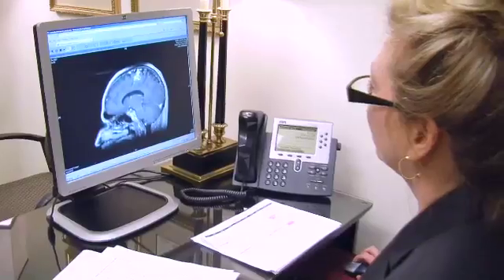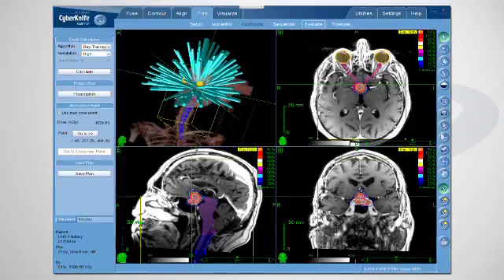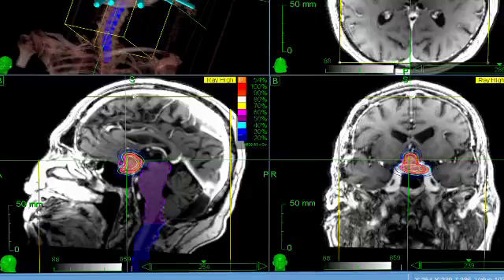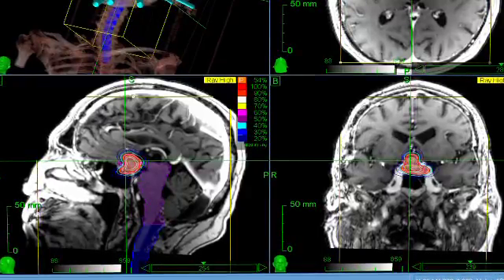Meningiomas, for example, have a control rate in excess of 90% with CyberKnife treatment. The same is true for certain kinds of pituitary tumors, where the CyberKnife can control or prevent regrowth in 90% or more. Removing the first 90% of the tumor is relatively safe and can often be done through a very minimally invasive approach through the nose or through a limited opening in the skull.